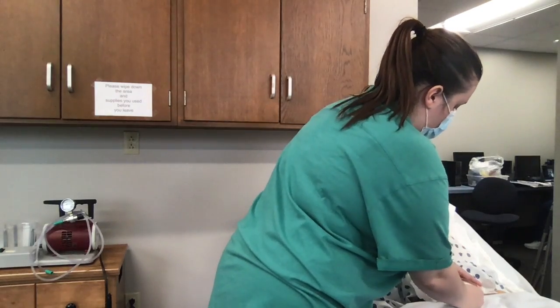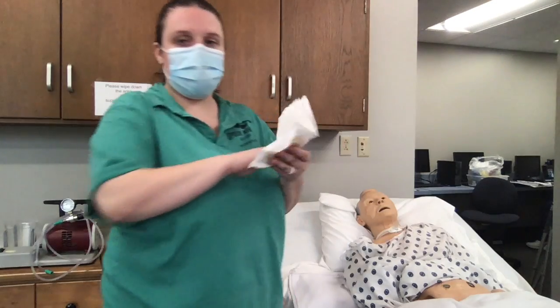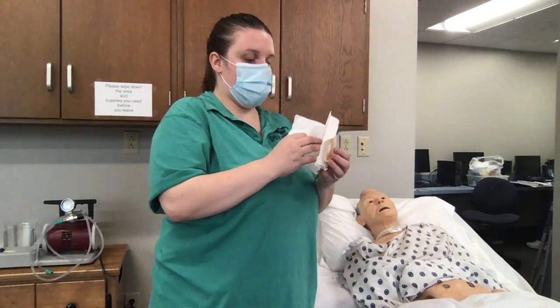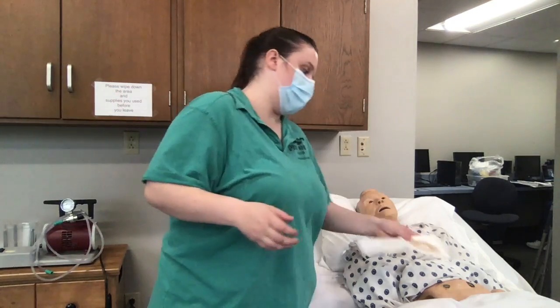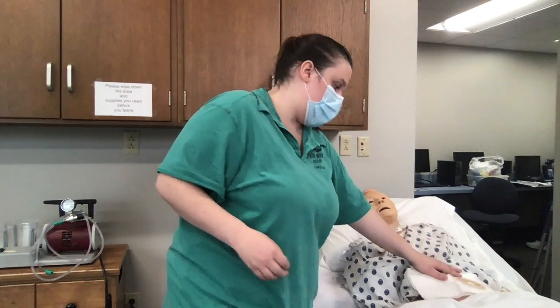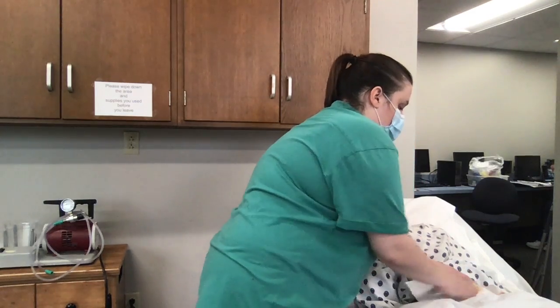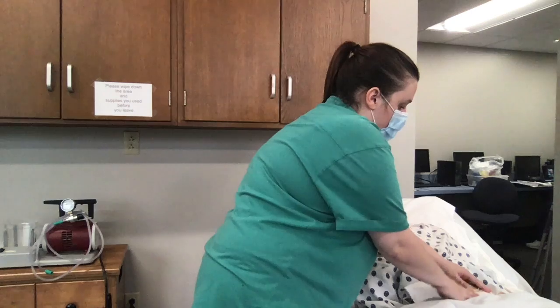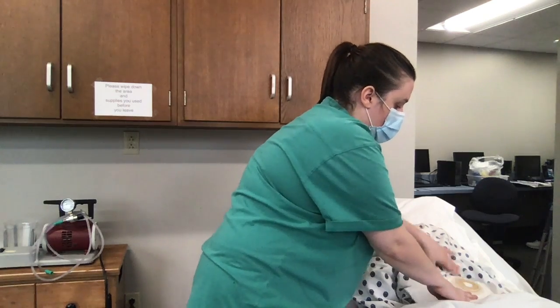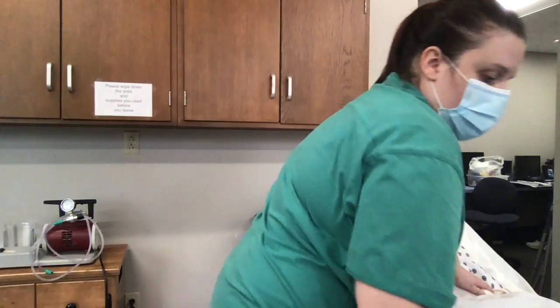And then I would replace this over the stoma. There is an adhesive on the back, but if necessary, I can use another type of apply-on skin adhesive if it's not adhering to the skin. I want to make sure there's not really any bumps or anything, so I want to make sure I'm smoothing it over, making sure it's properly sized for the patient.